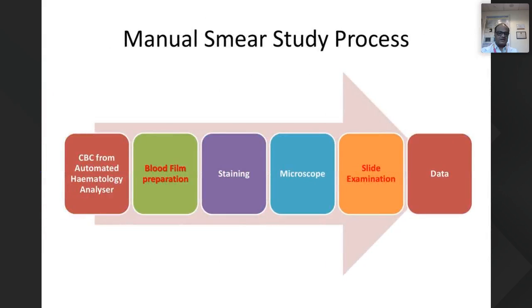In addition to this, if you look at the staining process itself, it involves control and stock inventory of good quality chemicals. pH should always be monitored. Coming to the microscope, most of the time the microscopes used by the screening people are different from those of a person who uses a hi-fi microscope like a Leica or a Nikon, which may have an entirely different field of view compared to locally made microscopes.